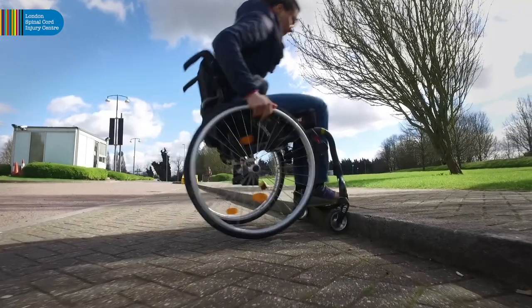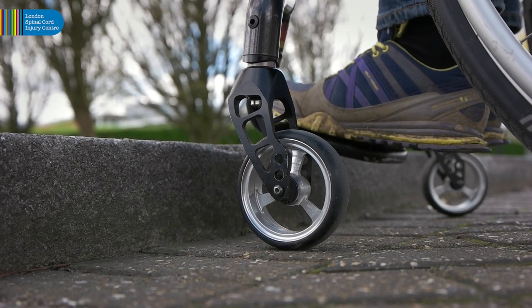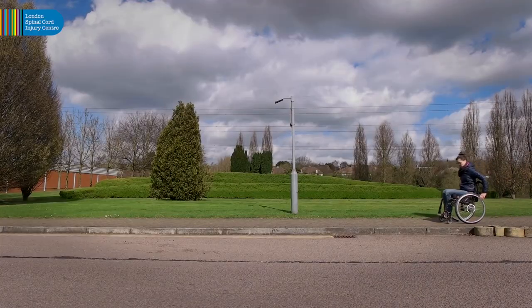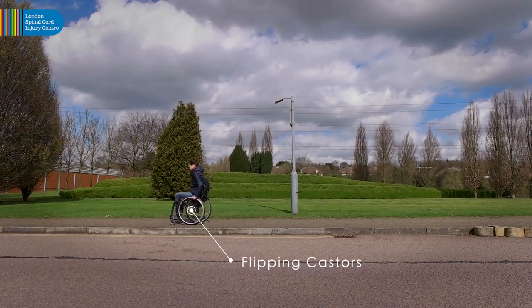Advanced manual wheelchair skills offer independent mobility in what would ordinarily be hostile terrains. Having mastered the skill of flipping casters in forward motion, the same technique can be used to ascend rises, with the ultimate achievement of ascending kerbs.